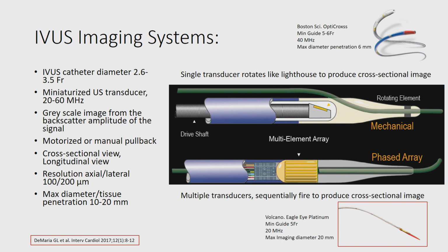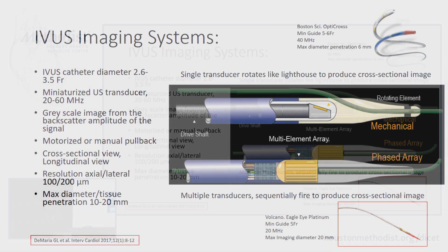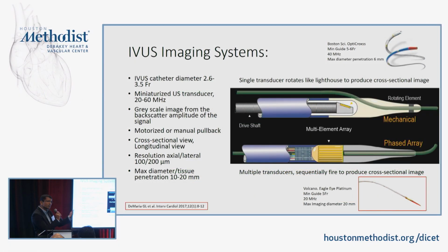Ultrasound, as you know, is just like echocardiogram. If you have been in the echo lab, it takes a long time before you understand what the shades of gray, all the way to brightness, actually mean. So it takes a little bit of time and experience to understand these, but ultrasound is ultrasound. It creates a grayscale image from the reflection of the ultrasound waves from structures.